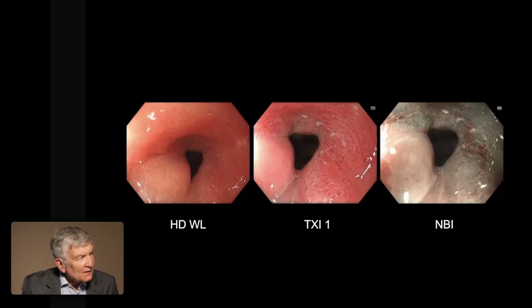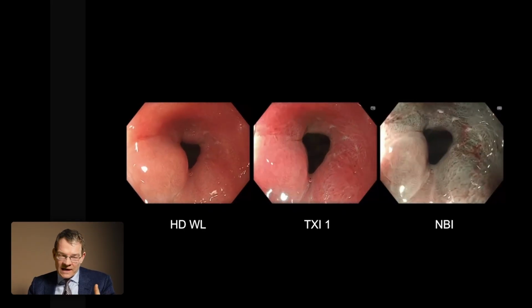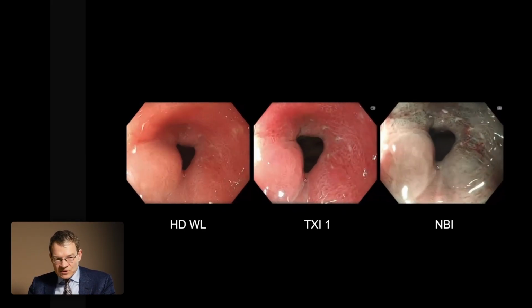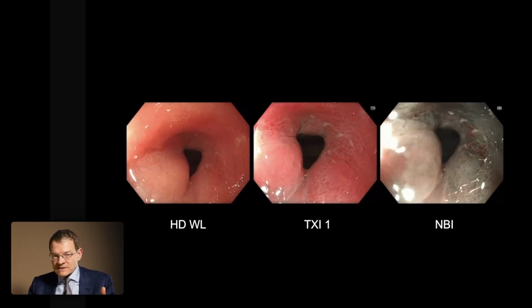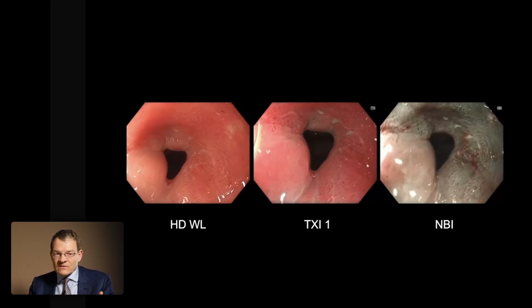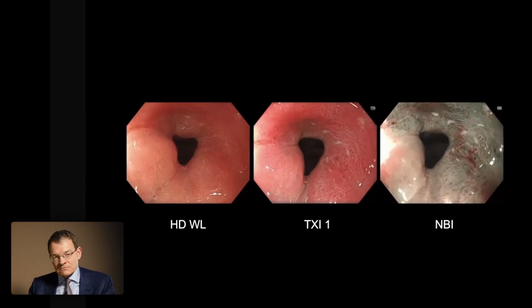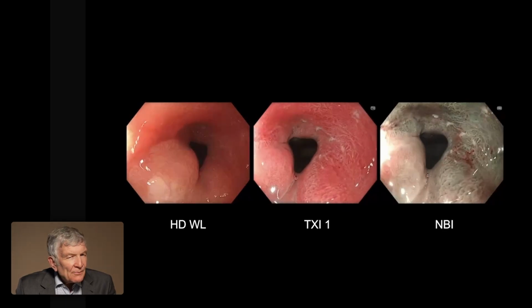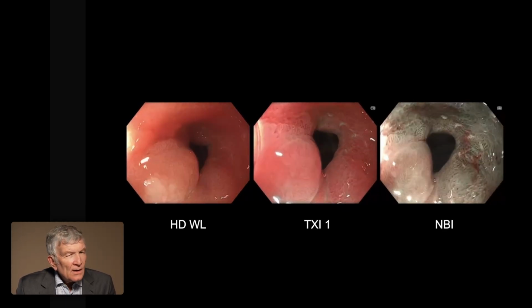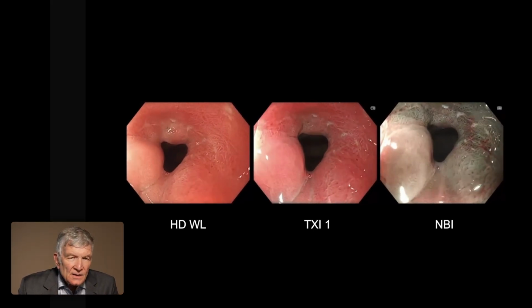But this seems sharper. It seems sharper because I think, especially in the Barrett's, I have the impression that you can better visualize the structure, and that makes it somehow sharper. And then you have also the advantage that the image is somehow brighter. It's more structured, perhaps definitely. You can better recognize structural abnormalities. Structural. We don't know the clinical outcome, but we're just focusing on pictures and see the difference.